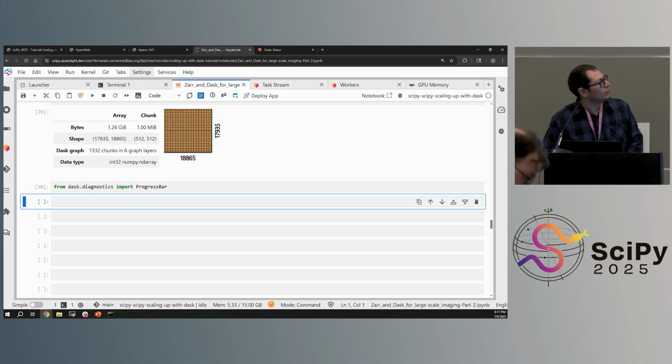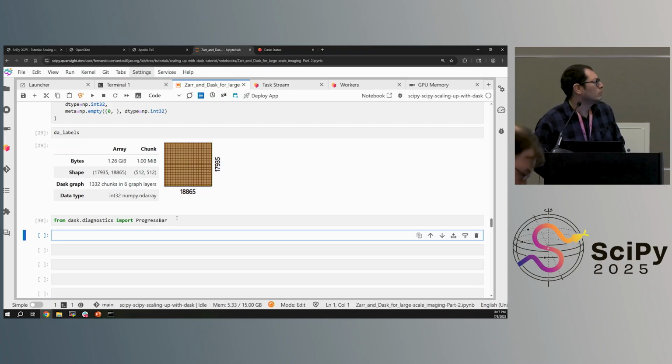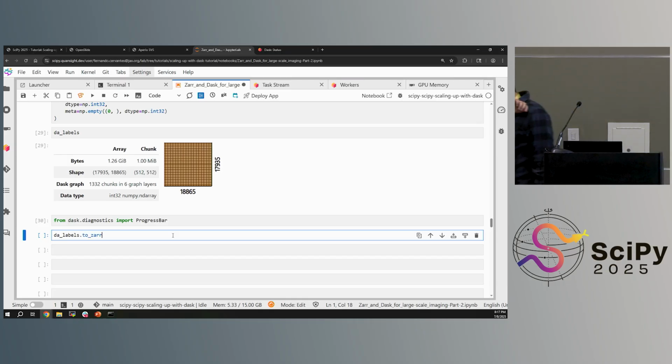But what Fernando did here is he converted it from label to RGB so that you get the different colors. So in this case, it's an overlay of the RGB labels, different colors, on top of the original image. You can see the tissue slices. Right. And what you had here was an overlay of the RGB colors on top of the binary mask, which is why it was so dark, because you weren't overlaying the image.